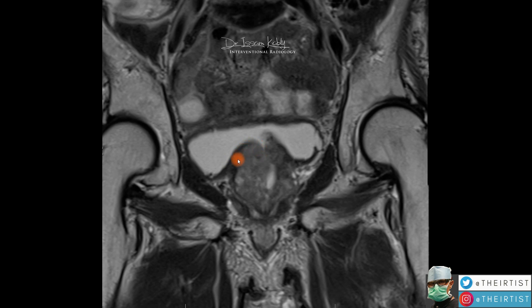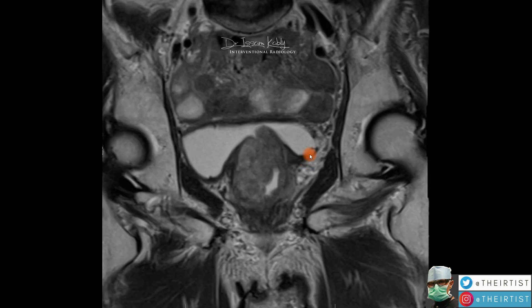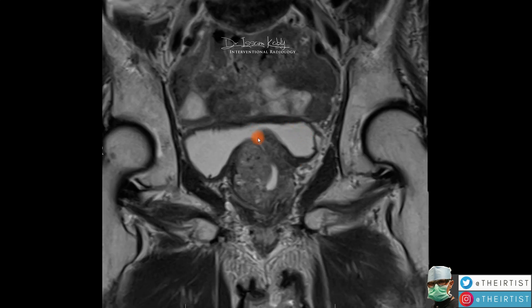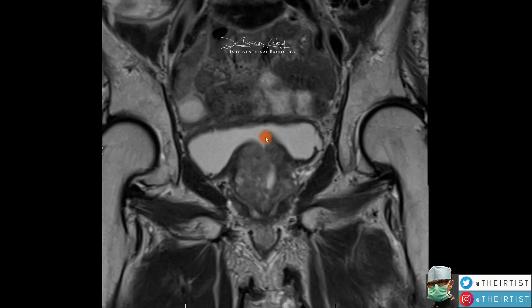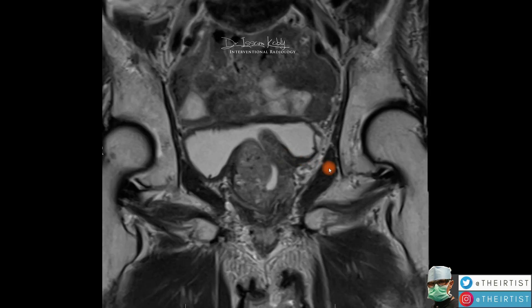We can see the protrusion of the median lobe of the prostate pushing the base of the bladder — this prevents men from urinating when they go into retention. The opening occurred because atrophy happened on the treated lobe, deprived of its blood supply and oxygen, causing it to shrink. Importantly, we don't permanently occlude the artery; we send particles into the prostate tissue to make it shrink, while the artery itself remains patent — so the gland doesn't die.